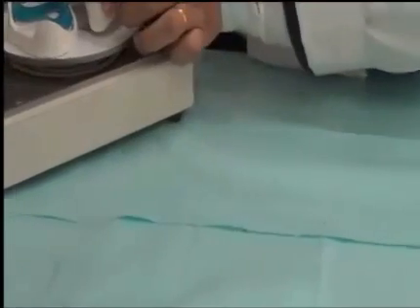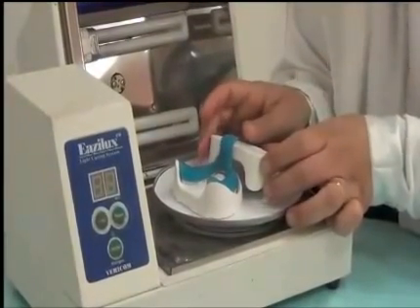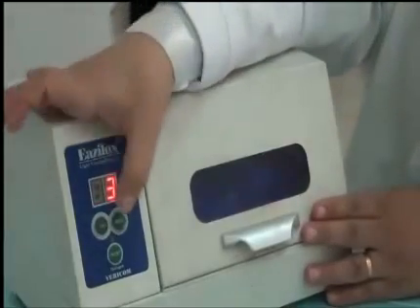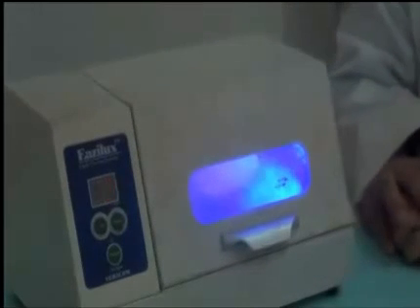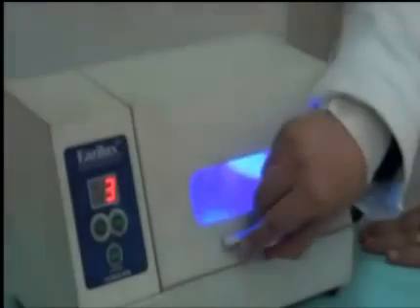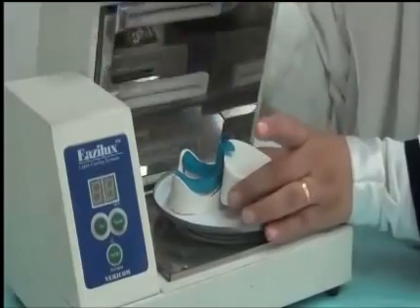I could place an old cast to do this purpose. I support my material so it doesn't slump in a manner that we don't want. We do an initial cure. We can wait for 20 seconds or more, and then once open, interrupt the cycle, and then remove the support. It's still soft, so I'm not going to remove the support.